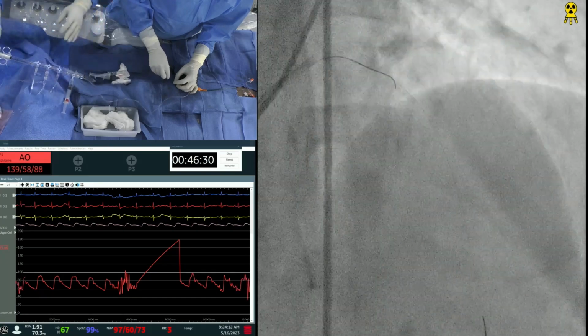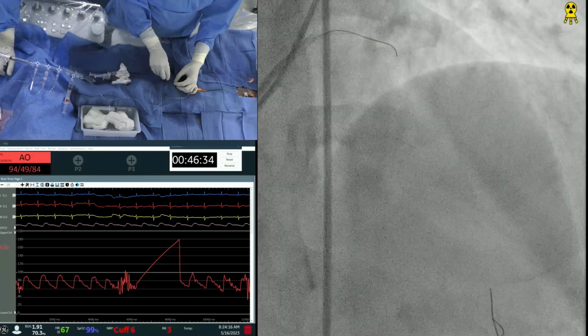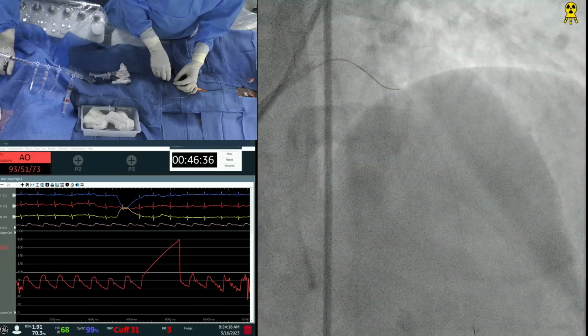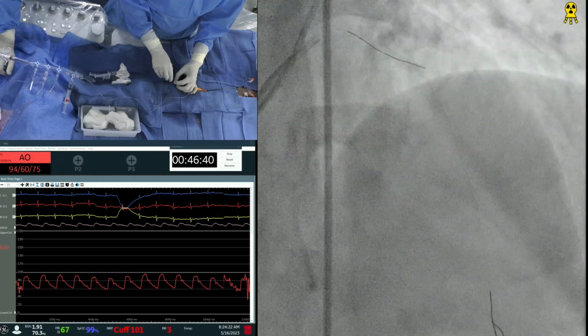Do you want to put a sharp, angulated turn? Probably we need a lot more wire. Dilate the LAD first and then use a Venture. But the question is, do you want to go to the LAD once? No, second. You're going to the pouch.